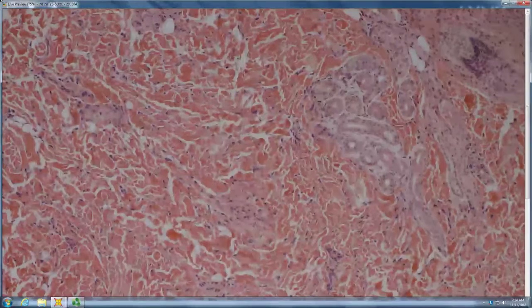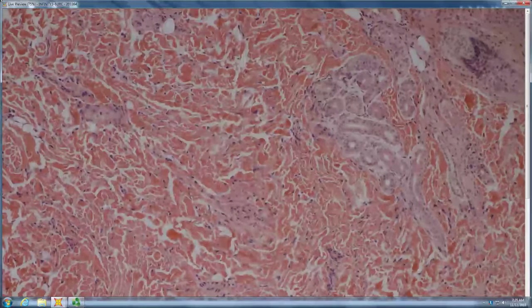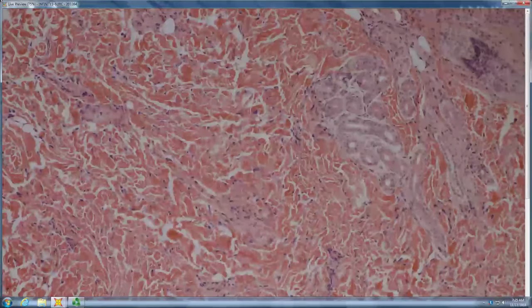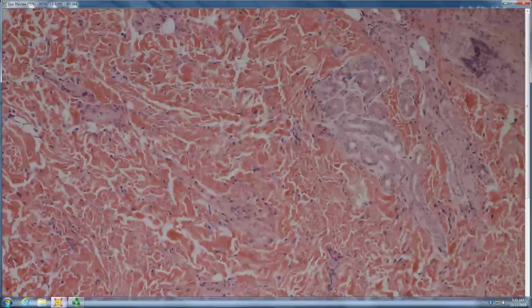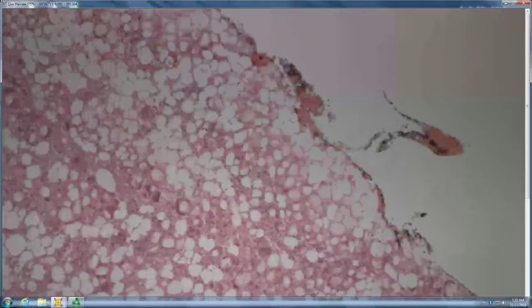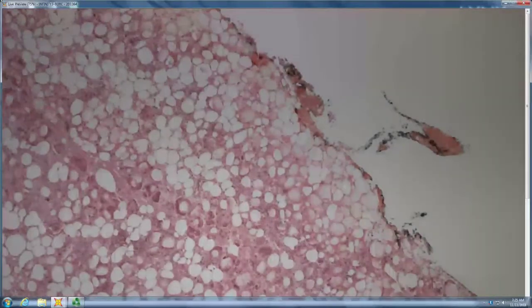So look at the dermis. If the dermis is bright red, with small collagen bundles and lots of fibroblasts, that's kid skin. And if it's adult skin, then it's less likely subcutaneous fat necrosis of the newborn, more likely post-steroid fat necrosis. And the two both show granulomatous panniculitis with those rosettes.